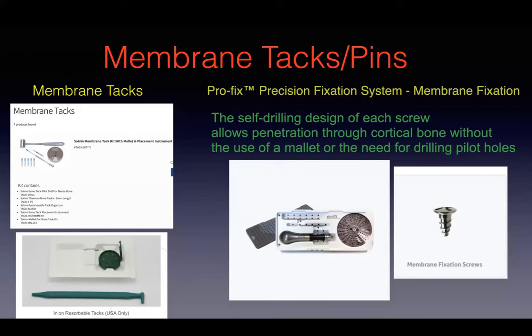Remember, membrane tacks and pins. There's different tacks and pins available in the market to secure your membranes. I use the membrane tacks on the upper left with the mallet. There's Profix also. That's a very good one to use. It's a lot more expensive, but the advantage is you don't need to use a mallet and you don't need to drill any pilot holes. And if you don't like to be retrieving your tacks after the GBR is fully healed, there's also one that resorbs on the lower left. And these tend to start to break down after about 8 weeks.